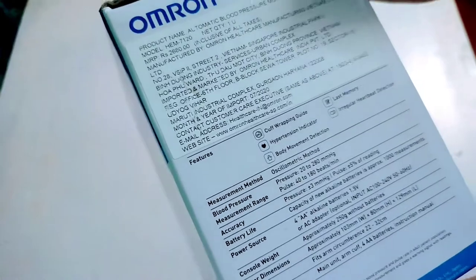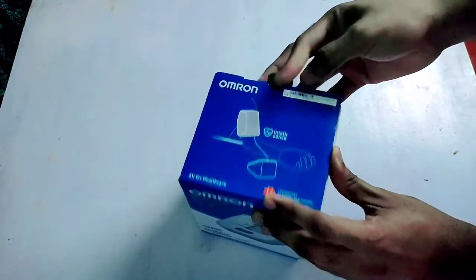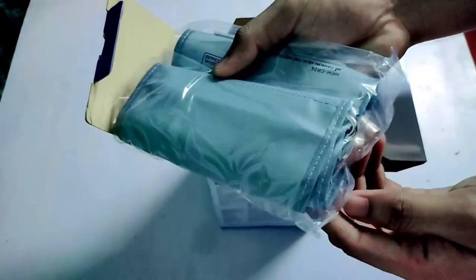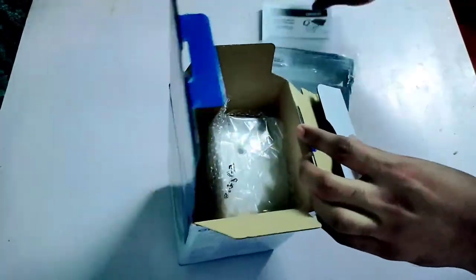The MRP mentioned here is 2680 rupees. Here we have the arm cuff along with four double-A sized alkaline batteries, some documentation, and the main BP monitor itself.